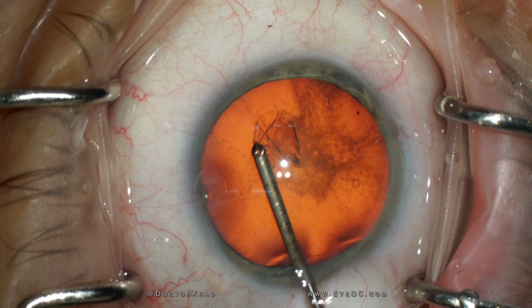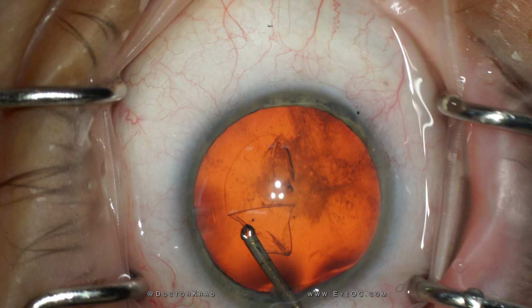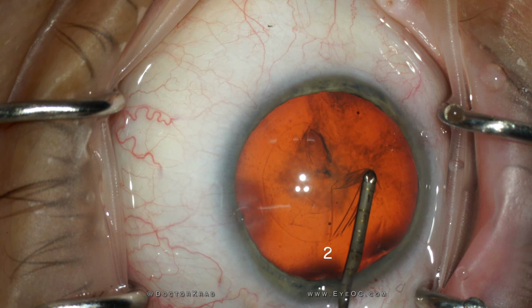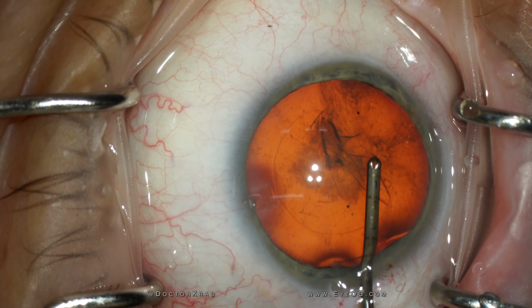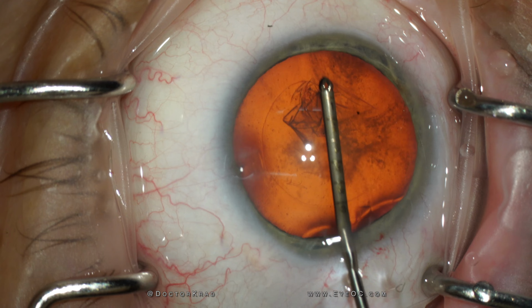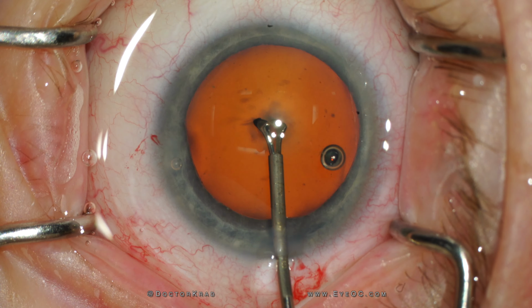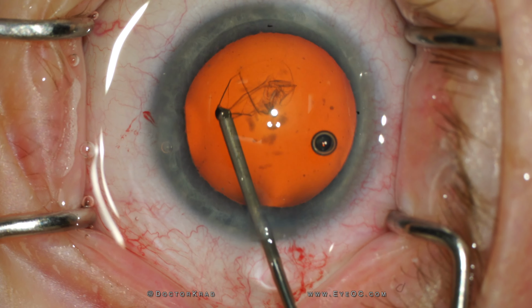Over here, this patient is blinking a lot, causing his eye to shake, but I just focus on getting to the next of the 4 points. When I adopted this strategy, my RHEXIS has become so much more consistent. So try it out and please let me know how it goes. The rest of this video is just me demonstrating the technique over and over.